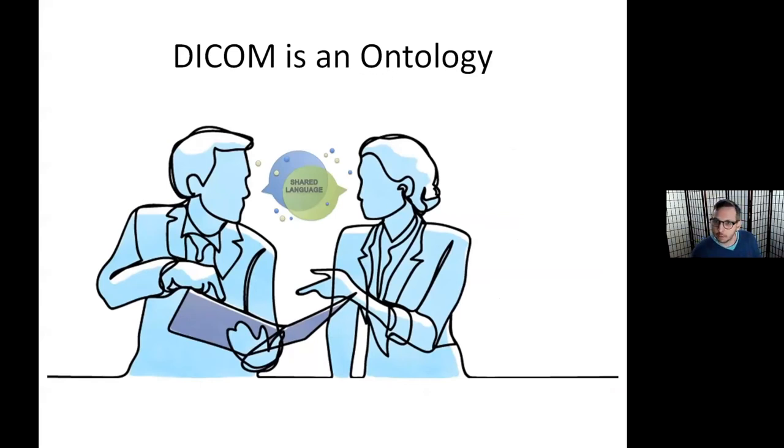Here's one of those words that I asked about, one of those keywords. Ontology. DICOM is an ontology. It's a shared language.